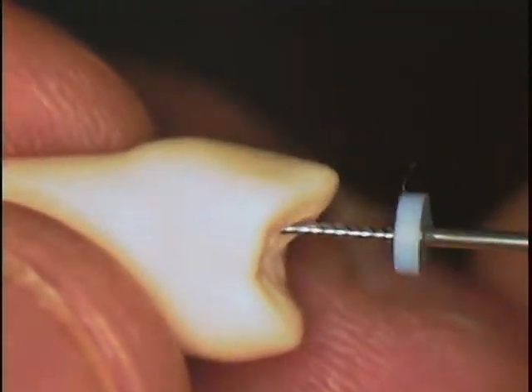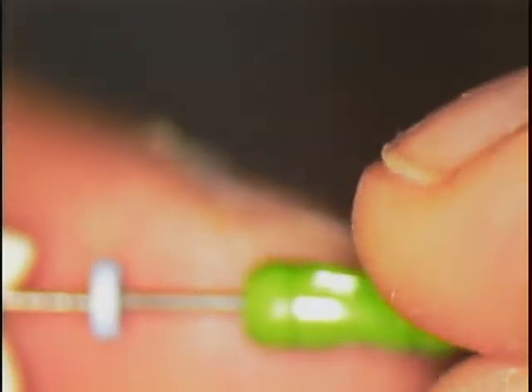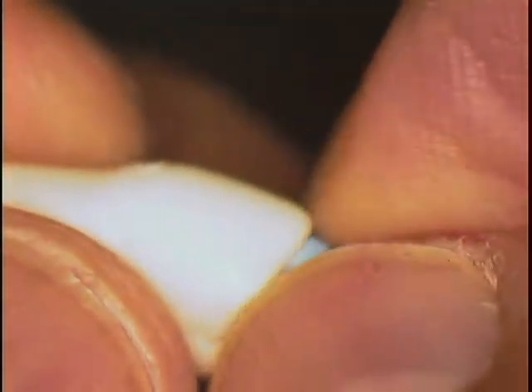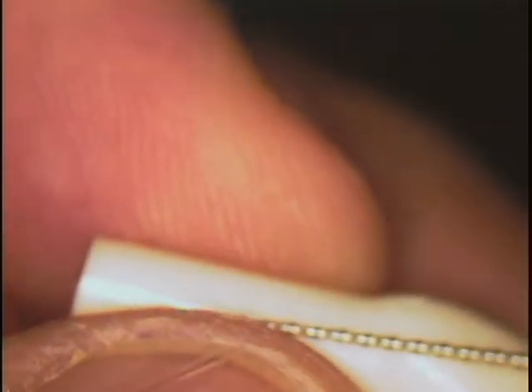See, now I got a lot of resistance. So what happens when a 35 file is caught like that? And you know you're pretty short. That's pretty short, considering that's where my file ends. So I want to show you one thing later. I'll show you on the chalkboard why that's occurring.